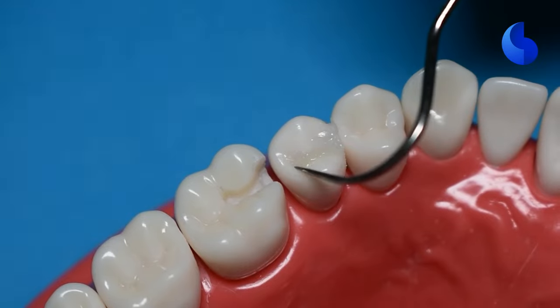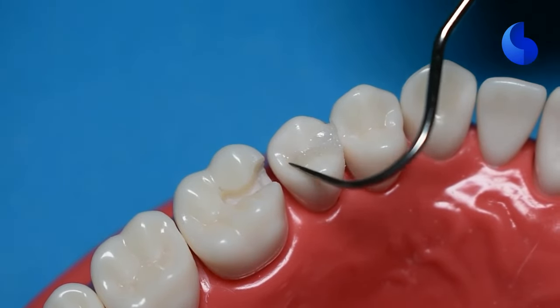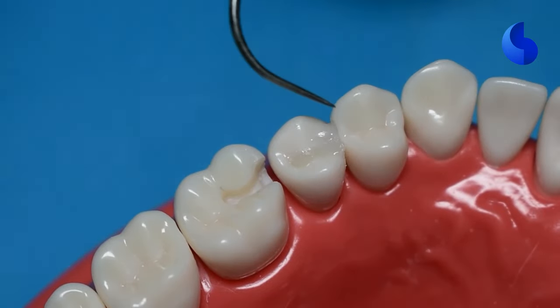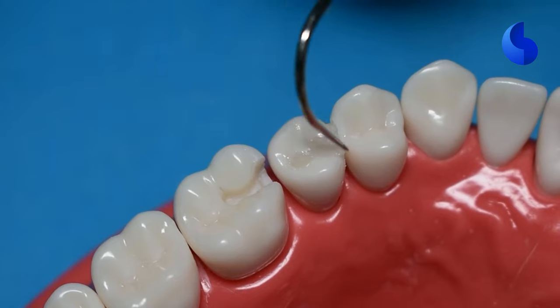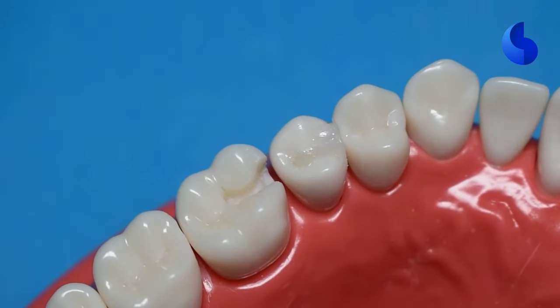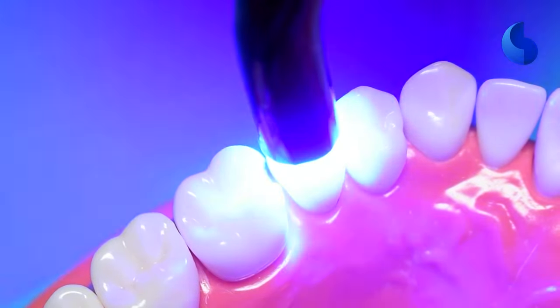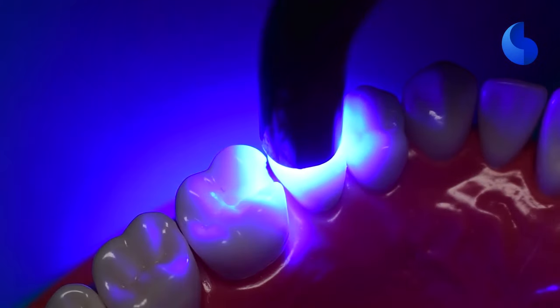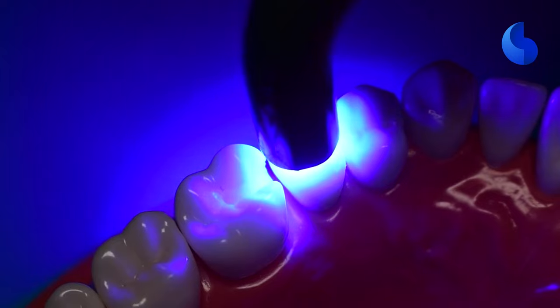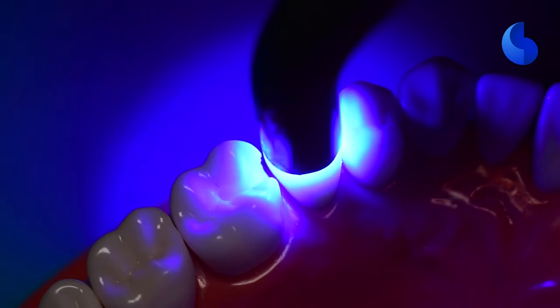You can also use an explorer, make the transition smooth and create a little bit of anatomy. It's much harder to create anatomy with composites than you can with amalgam, but you can do your best to at least create the primary grooves and the triangular fossa that they're looking for.